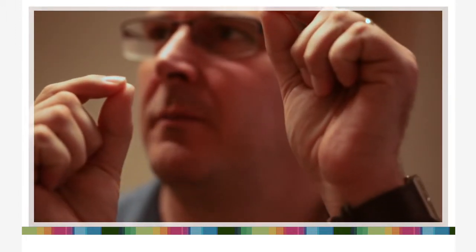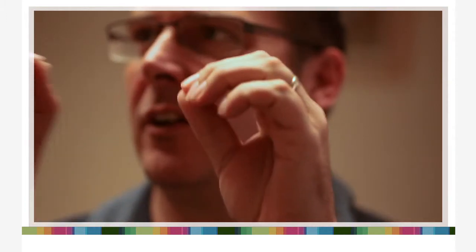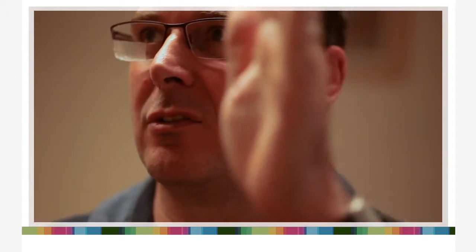Are you keeping fixing on the... I'm fixing on it, but I'm using what I do with the prism because I fix on it, you end up using both eyes. Yes. So one eye's doing one thing and the other eye's doing another. So as you're going across, I see the starts of an awareness. Awareness, yes. Which then makes my eye naturally move. Okay. Now I can still see that black mark there, yes. But it's like my left eye takes over looking forward and my right eye does the prism. The attention is elsewhere. Yeah, so it's basically double, you do two things at once.